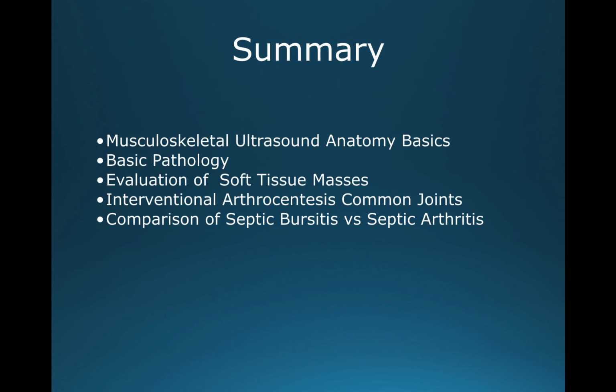So these are the things that I'm going to be looking for when I'm doing a physical exam. And I think the musculoskeletal ultrasound basically augments my physical exam when I'm doing a lot of different joint exams in the ER. When I'm looking at either the shoulder or the knee or the hip, the musculoskeletal ultrasound will really be an extension, or kind of the fifth arm, of the physical exam.